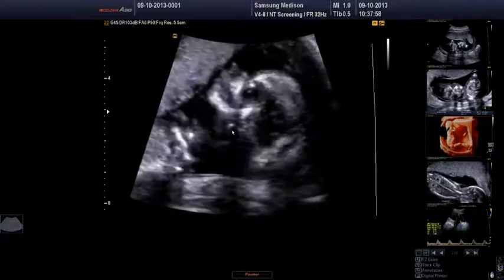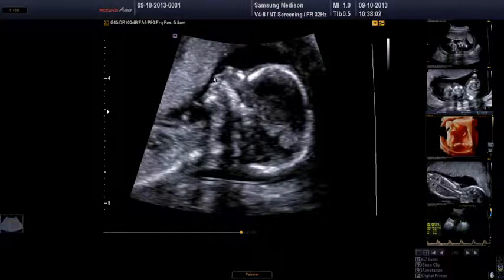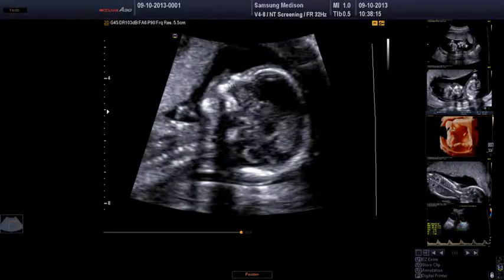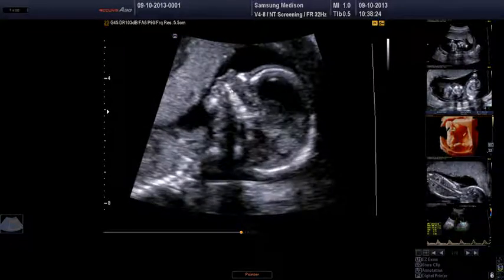I've just frozen here to show you the maxilla. You can see that if we're exactly in the midline, you get this thin wedge shape, whereas if I come a little bit more lateral, you get this extension here. So you can use this as a means of making sure that you're nicely in the midline when you're doing this imaging. And that's the nasal bone there, and you can see we're in the midline there.